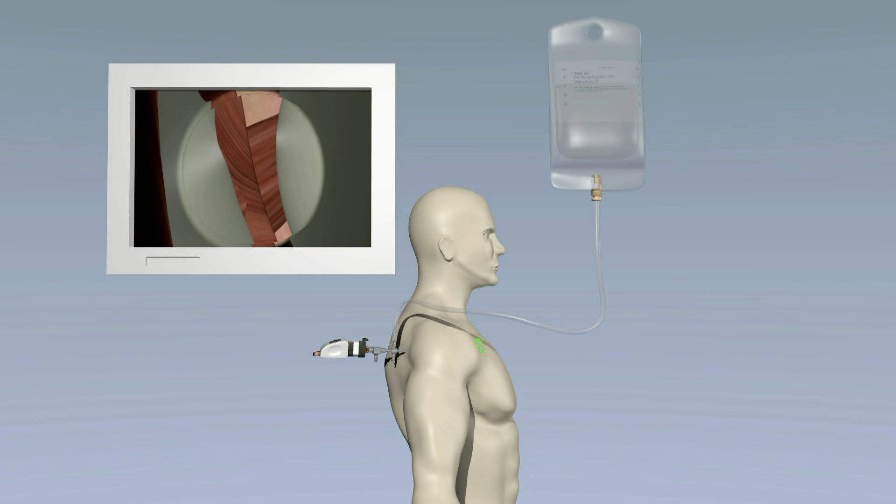A second incision becomes a portal for any of a wide variety of instruments that can be used during shoulder arthroscopy to repair damage, remove debris, and serve other purposes.